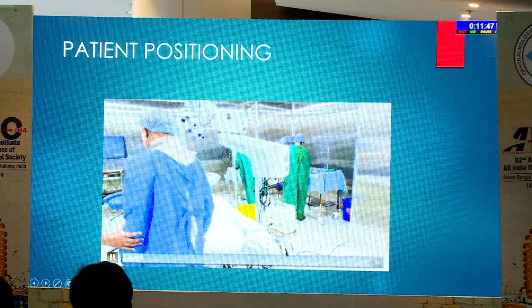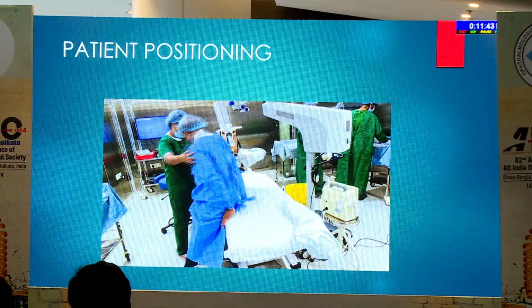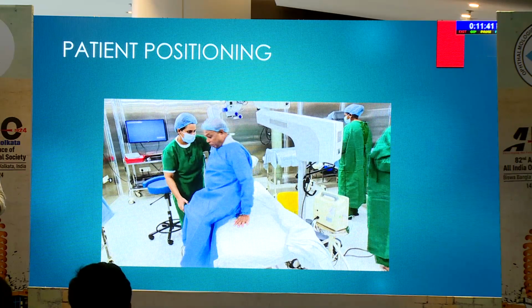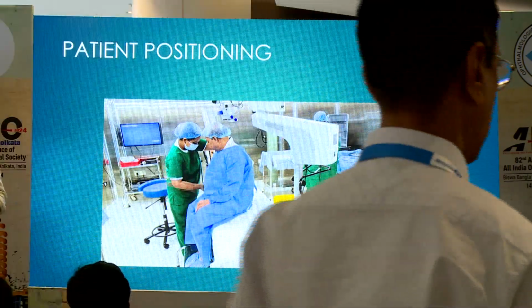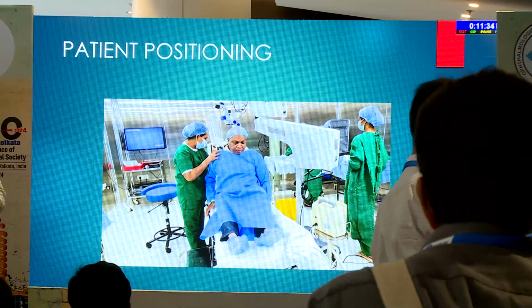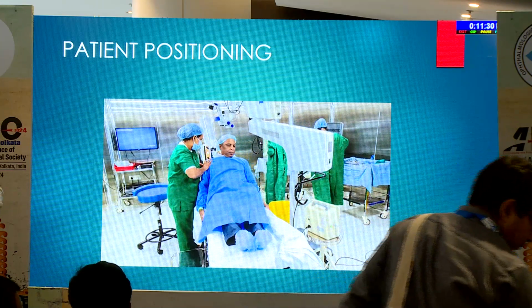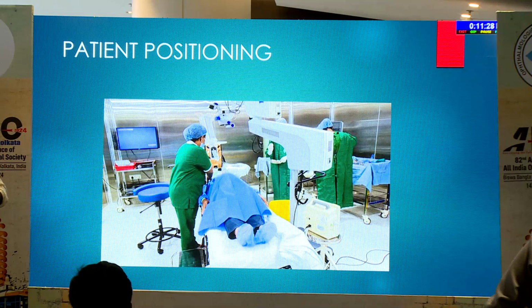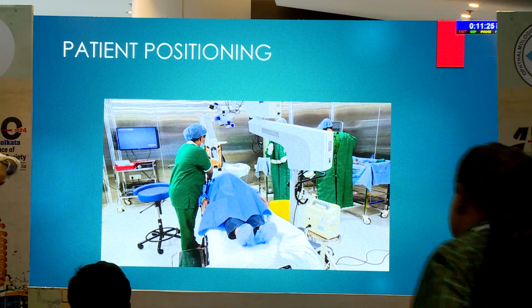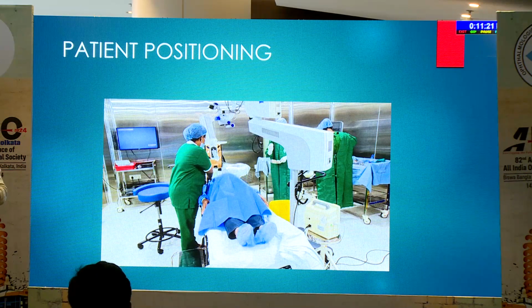And now shifting the patient and making the patient comfortable while lying down. This is very important. Especially in a topical phaco, we need the patient to cooperate as much as possible regarding the head position as well as the positioning. When you make the patient lie down, you have to make sure he lies down in an adequate position where the head end reaches the end of the headrest. If there is a gap in between, you can have a problem. If his head is tilted to one side, again you can have a problem.